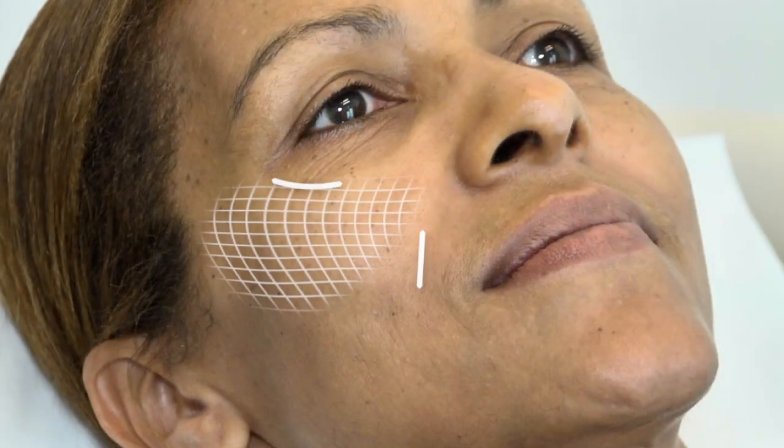Injections can also be made using adjacent bolus techniques, the pillar technique, when volume loss requires greater projection. The main bolus meets the summit of the malar eminence, and contiguous boluses are set up based on the physiognomy of the area being treated to ensure a harmonious connection with the zygomatic arch at the back and the centrofacial region at the front.